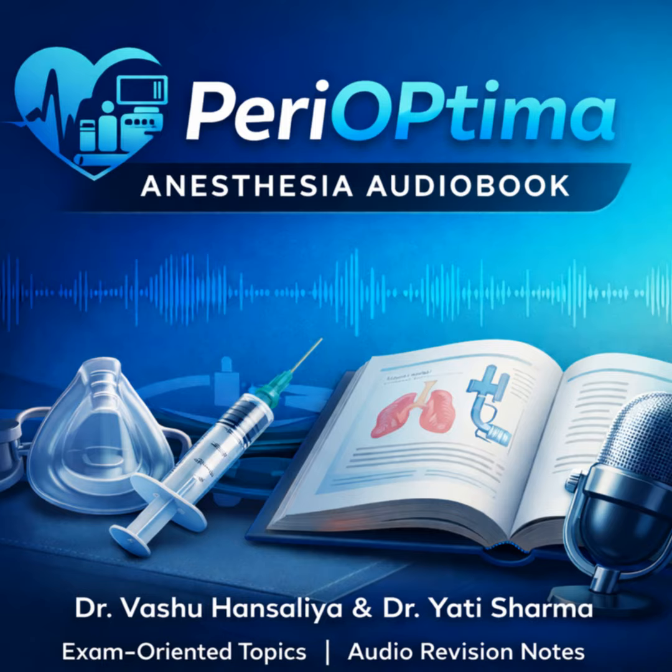We'll bullet point that. Now, orienting the image, B mode versus M mode. B mode is easy. Brightness mode, that's your standard 2D slice. Yeah. 95% of your work is B mode. But M mode, that's a classic viva trap. What is M mode actually showing you? M stands for motion. It's like looking through a keyhole, right?